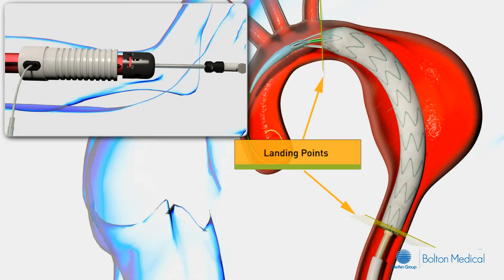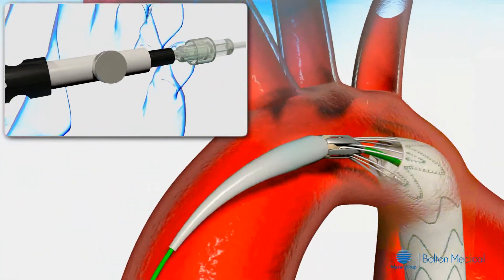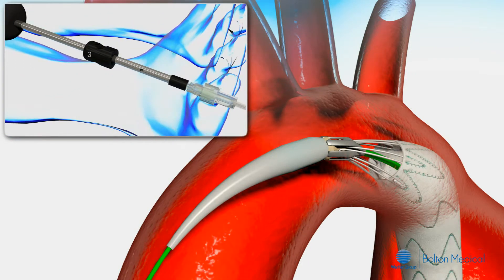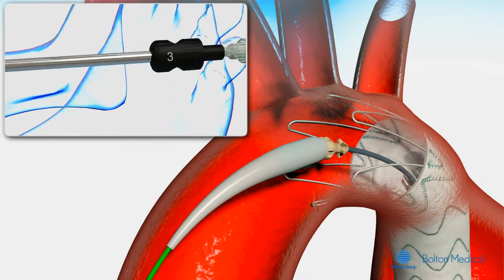At this point, the stent graft is fully deployed and the bare metal stent is still attached to the delivery system. Remove the apex release retainer by loosening the thumb screw. Release the bare stent by pulling the apex release grip marked number 3 completely towards the guide wire lure. At this point, the stent graft is in the final position.